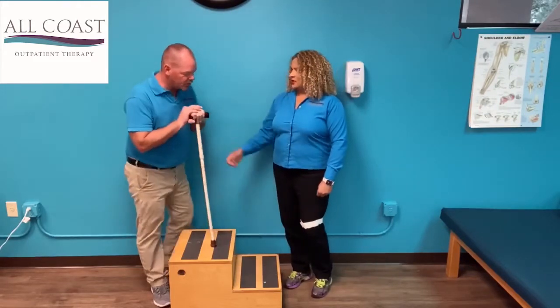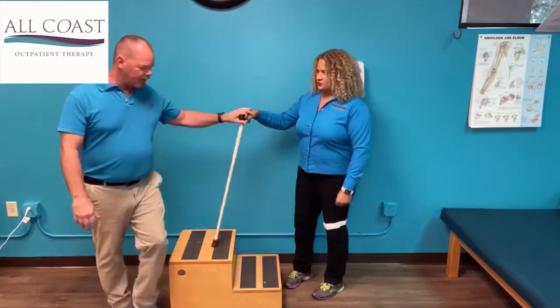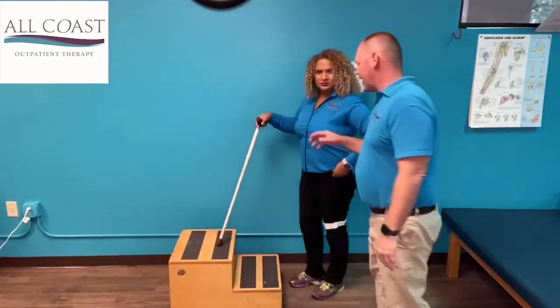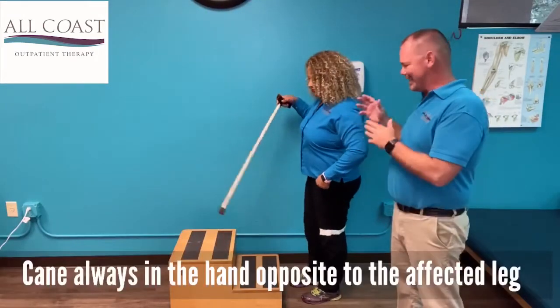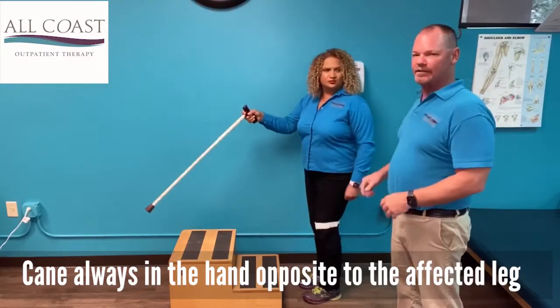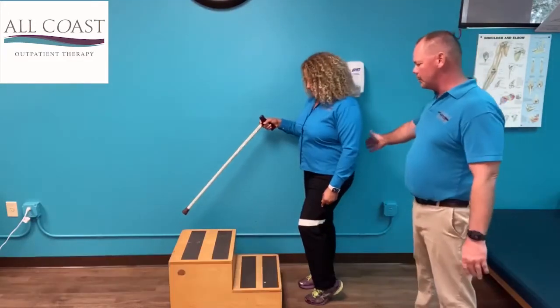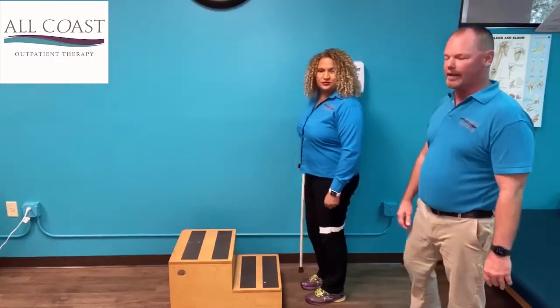As we talked about before, your cane always goes in the hand that's opposite your affected leg. Her left leg is affected, so she's going to carry it in her right hand.